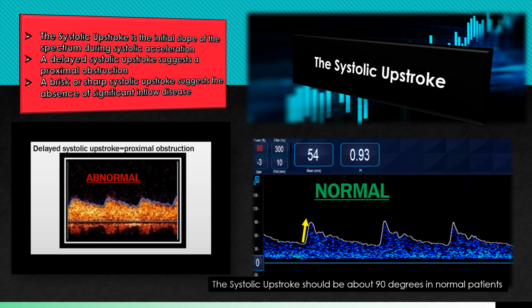So you can see on the bottom right, this waveform is a normal waveform with a normal systolic upstroke. A systolic upstroke ideally should be 90 degrees in a normal patient. When a systolic upstroke is delayed, as it is here on the bottom left, this usually indicates a proximal obstruction or a narrowing of some sort before this waveform is found.